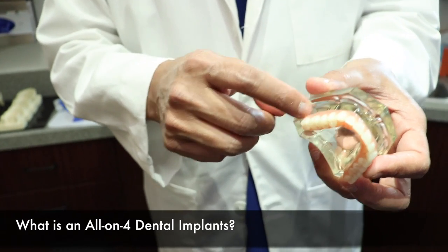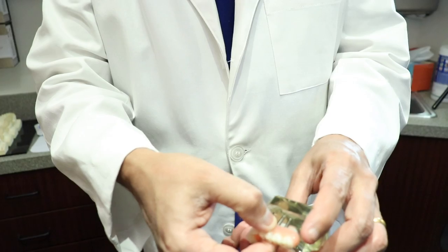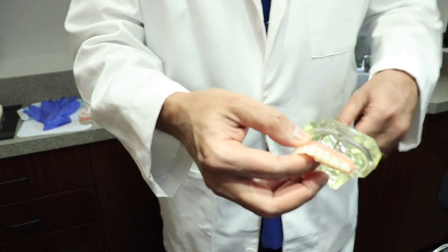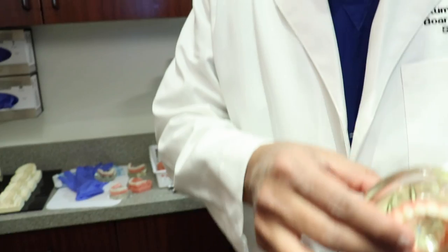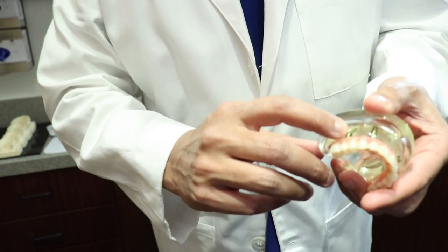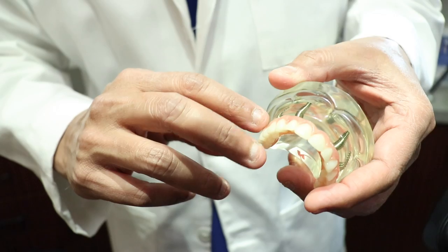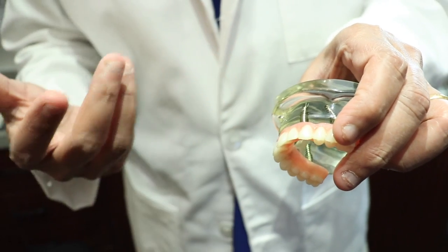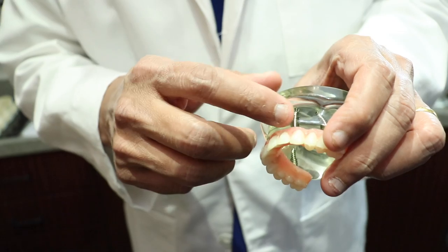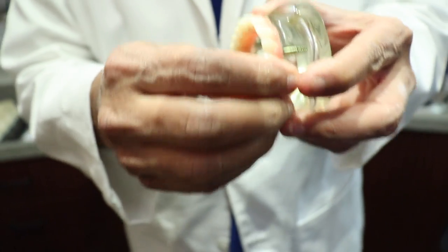However, a challenge we sometimes face — particularly in the upper jaw — is sinus involvement in the back, which means we can't place implants as far back. To avoid the sinuses, we are able to tilt the back implants at a 30 to 45 degree angle, as you can see, and place the two front implants straight.